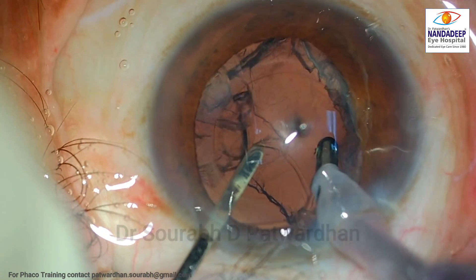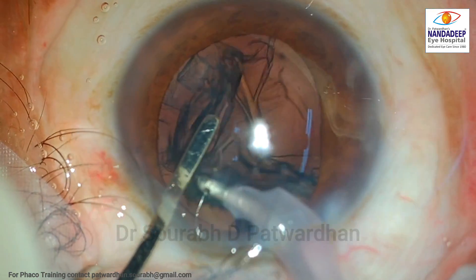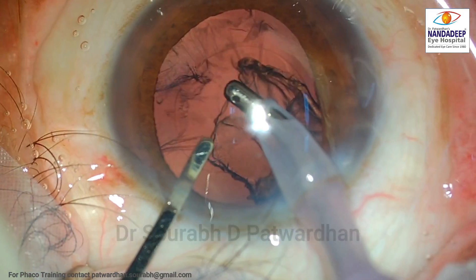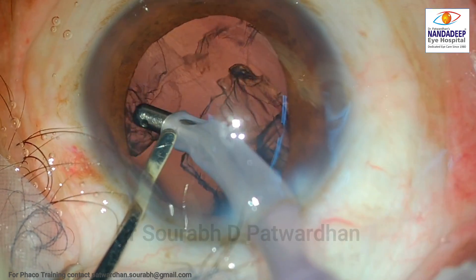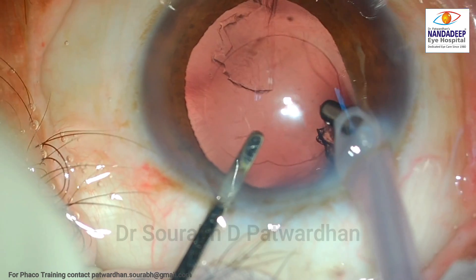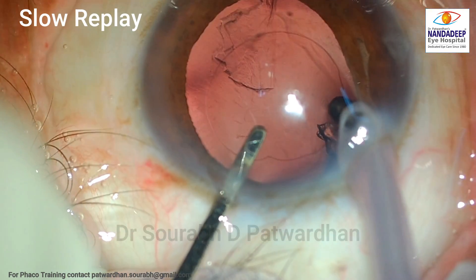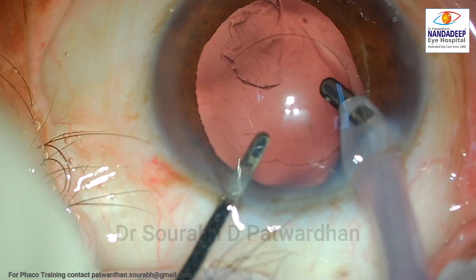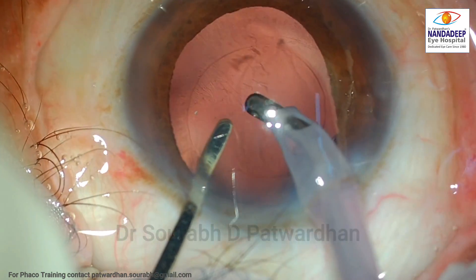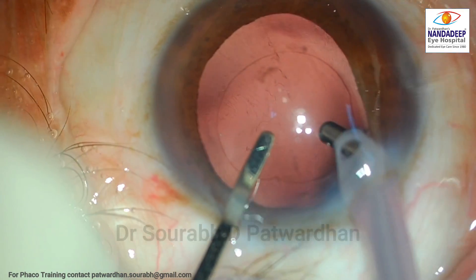The surgeon tried to remove the sub-incisional cortex first and then released it. Now the surgeon is trying to use low vacuum in the center just like Simcoe — that should not be done with the coaxial IA. Again, there is no control over the vacuum. Very high vacuum is used suddenly and that removes the cortex, but the peripheral cortex is cut off. That is why the peripheral cortex in the sub-incisional area remains and the surgeon has to struggle to take it out.